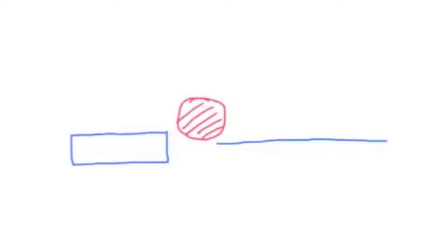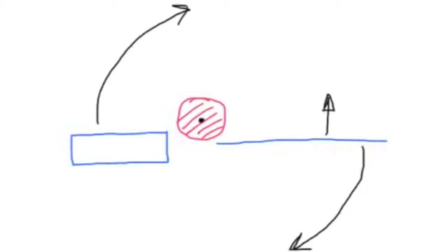Now, sometimes we can just push the needle away from us and get into the right position, but sometimes that doesn't work. The lesion pushes away with us as well, particularly in patients who have dense breasts. So another way of doing it is we can rotate both the needle and the transducer, using the lesion here as the fulcrum, the center of the rotation point. Here the lesion is away from us, or the needle's on the near side of us. And what we're going to do is rotate the hub of the needle towards us. We'll rotate the transducer away from us.